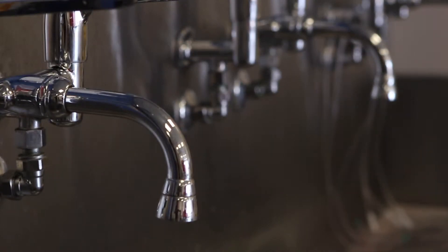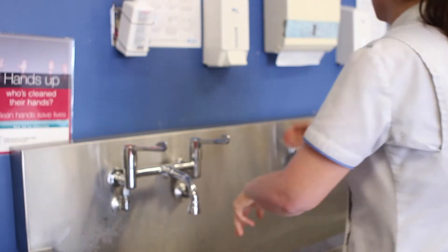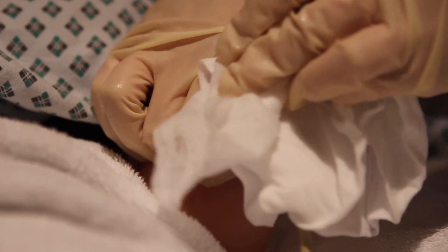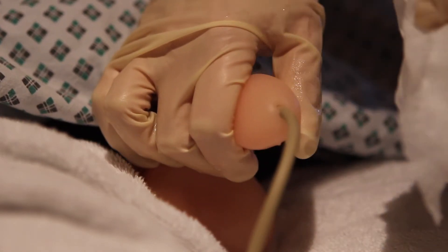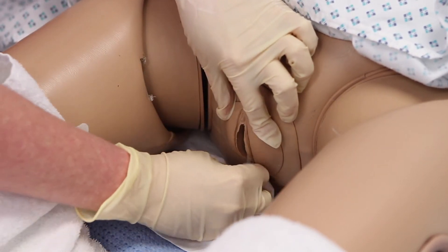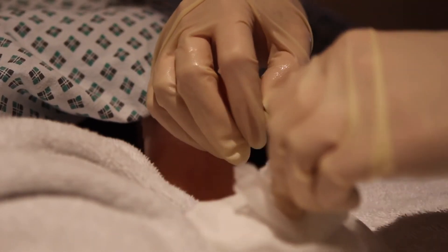Hygiene is of vital importance while you have a urinary catheter as it prevents the introduction of infection. You should bathe or shower every day with soap and water, paying particular attention to the urinary catheter. Males should retract the foreskin and clean around the urinary catheter before returning the foreskin to a normal position. For females, separate the labia minora and cleanse with a front-to-back motion. Catheter tubes should be cleaned in a downward motion away from the body.